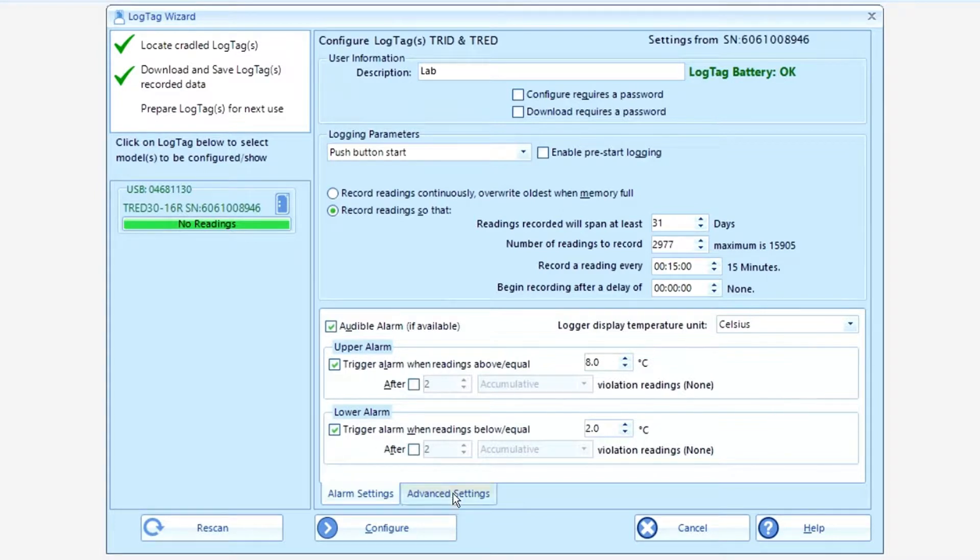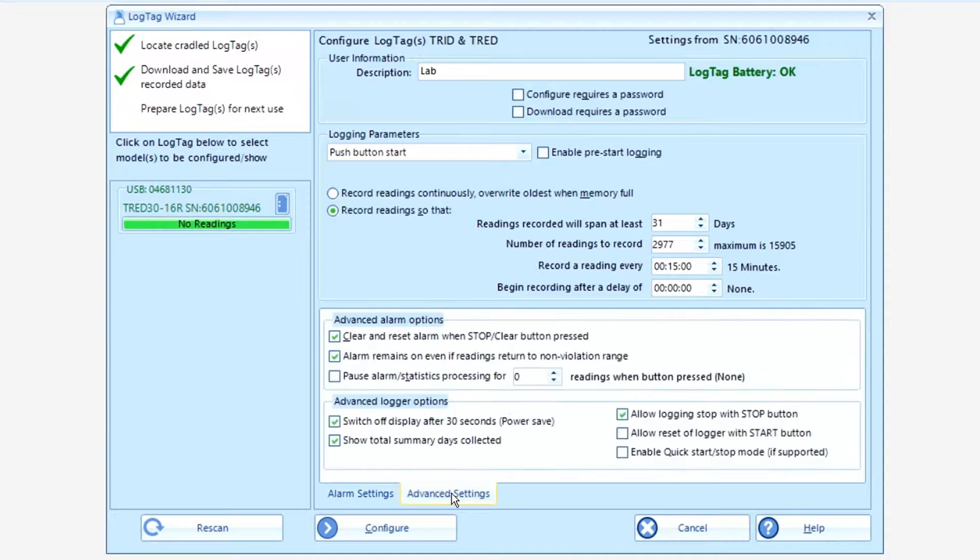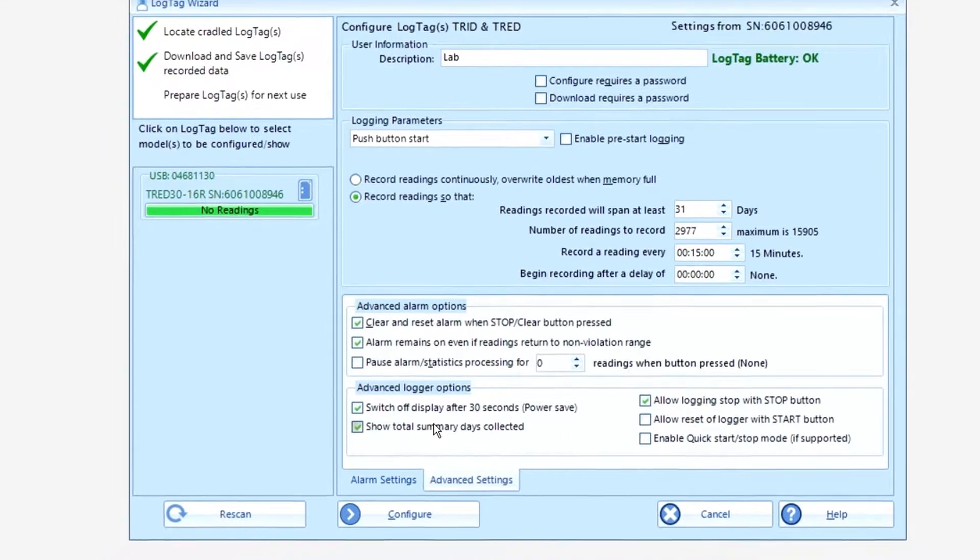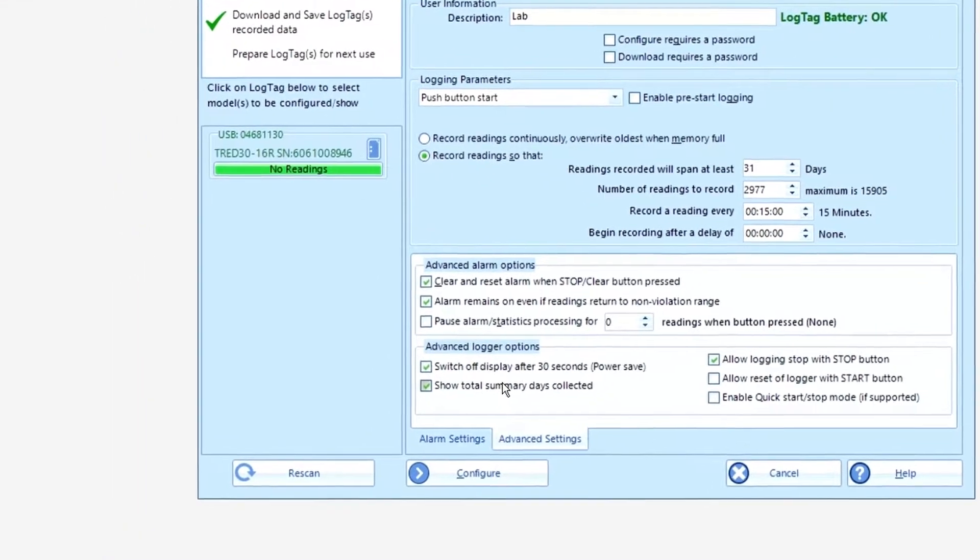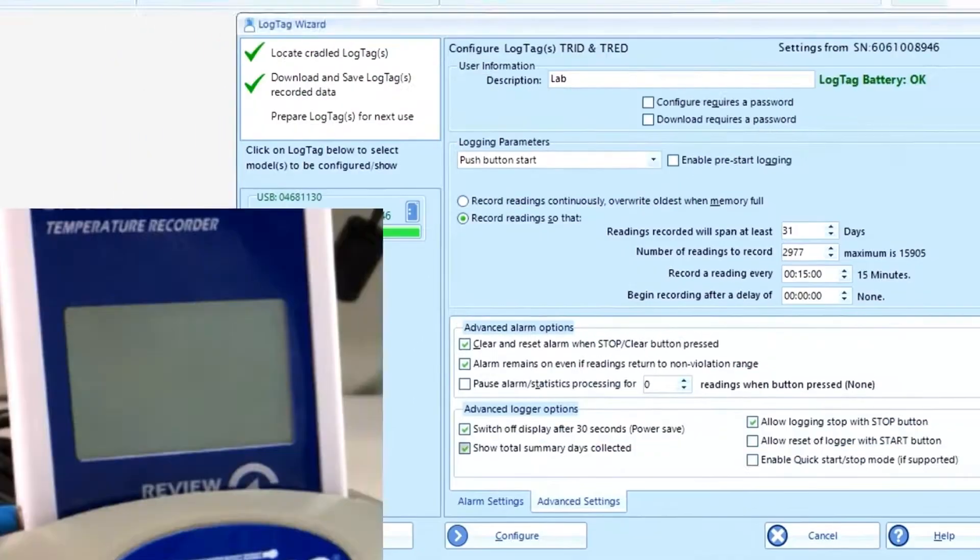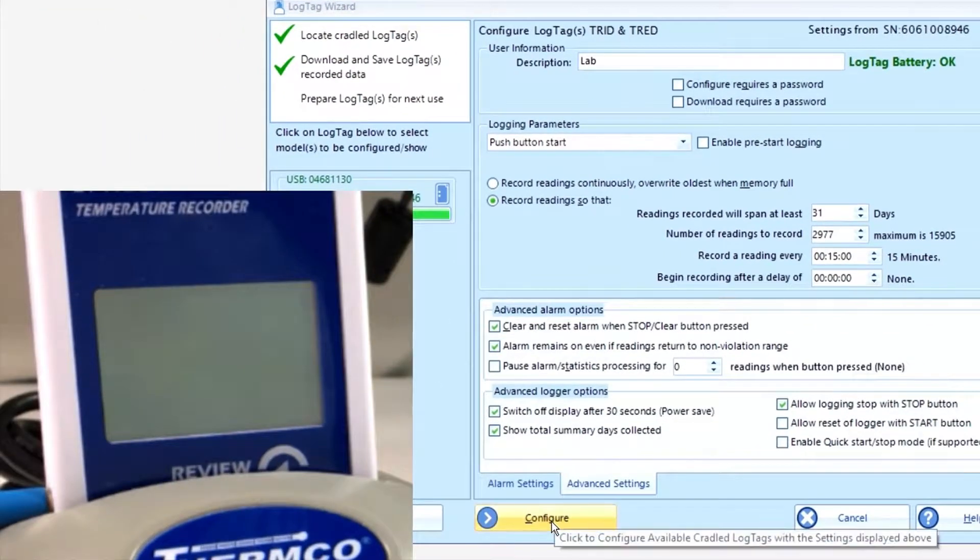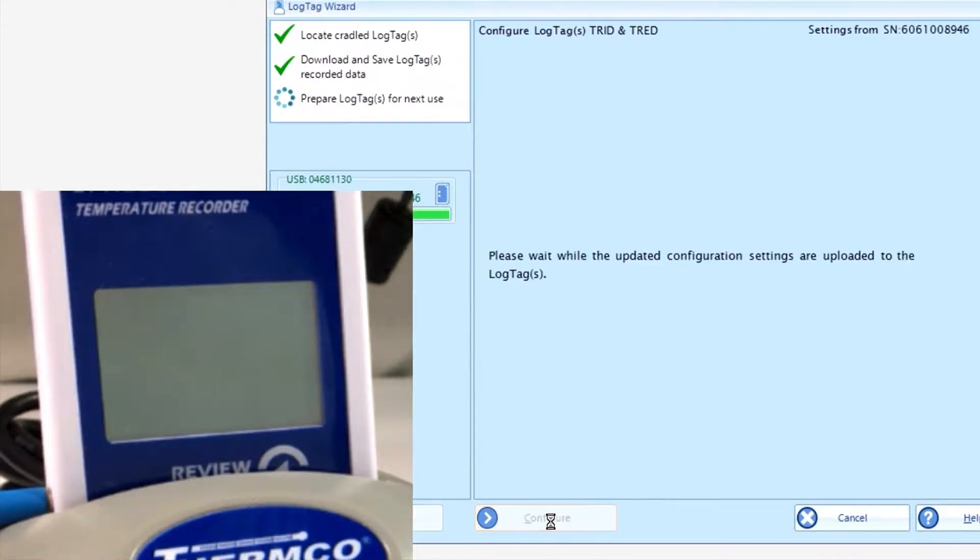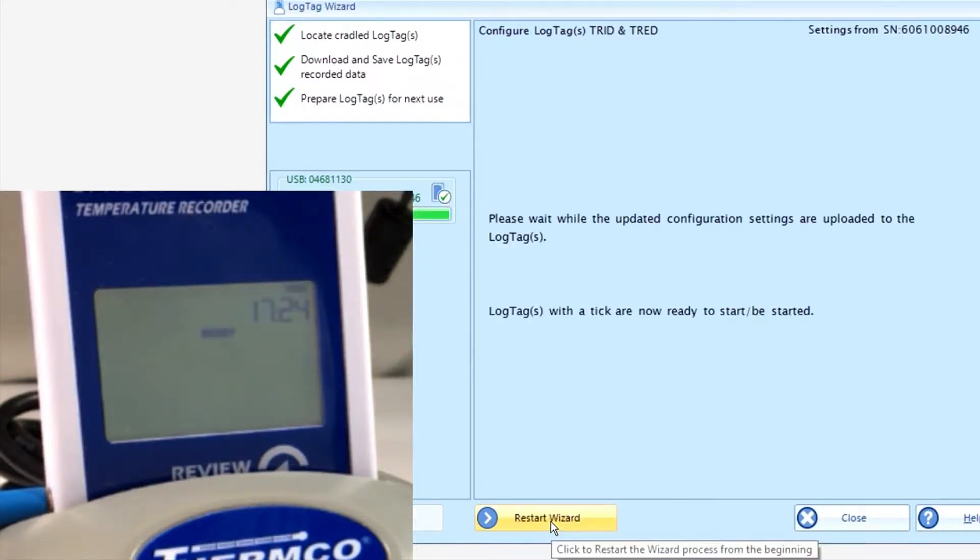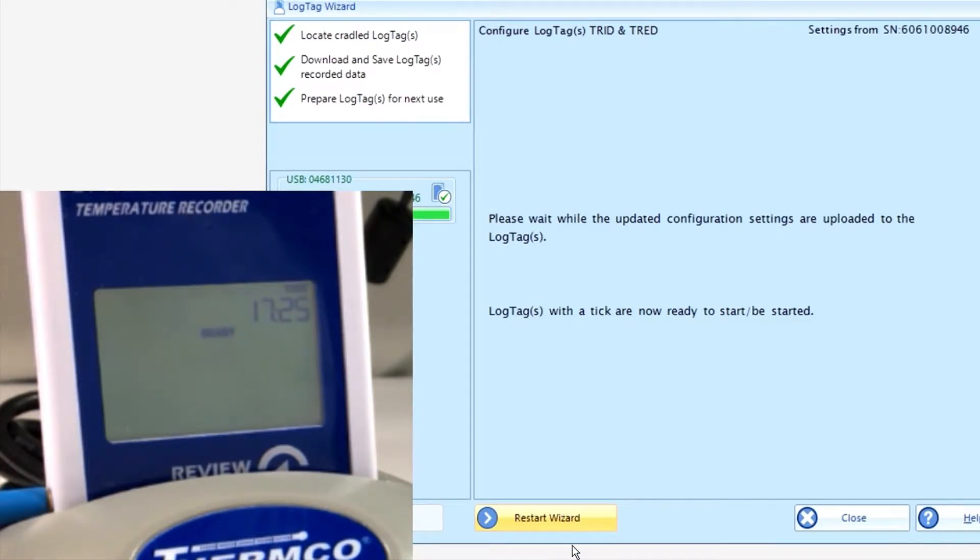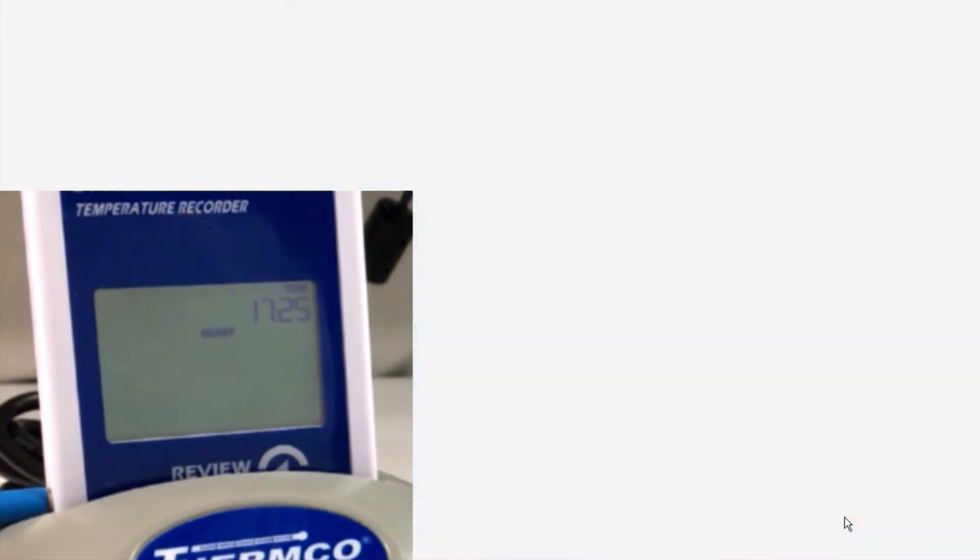Now, on the advanced tag, we recommend just leaving everything as they are in their default. And at this point now, you click configure and wait for the tone. And then you'll see on the screen, it says ready and the time. All you got to do now is close this and you're all set to go.